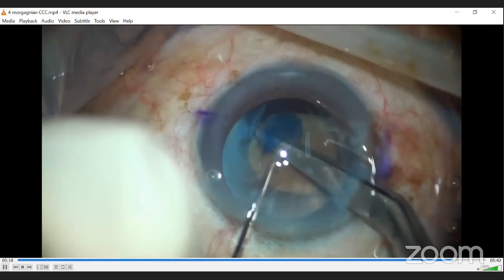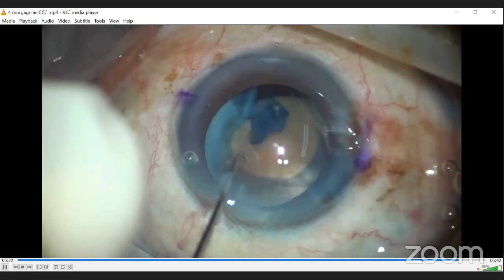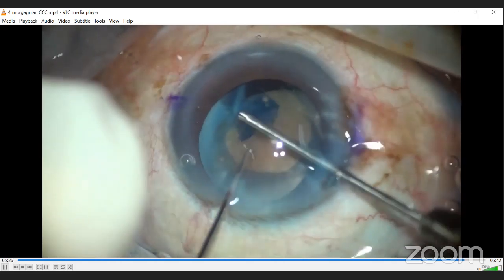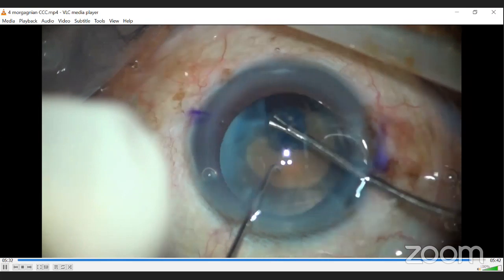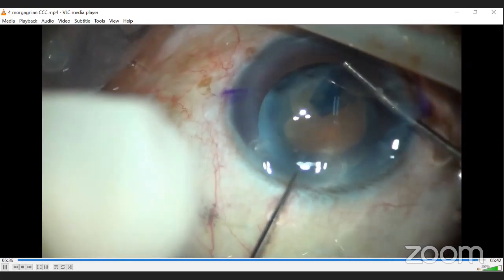be healthy. So in case of Morgagnian cataract or where the zonules are weak, we should not use the quick pull maneuver because it will lead to dialysis. So in such cases, it is better to leave it like that and complete the rhexis from the other side.